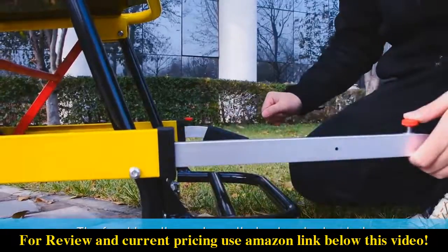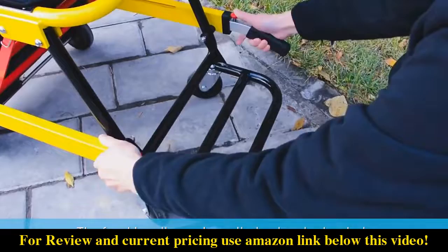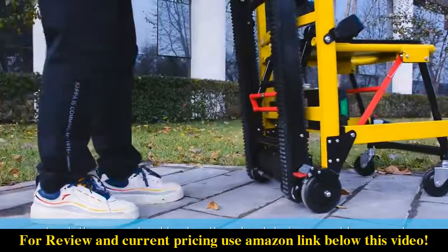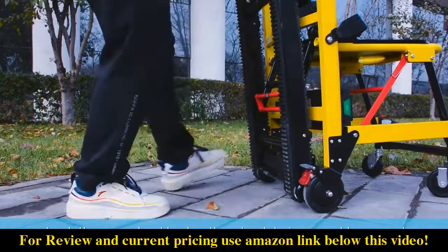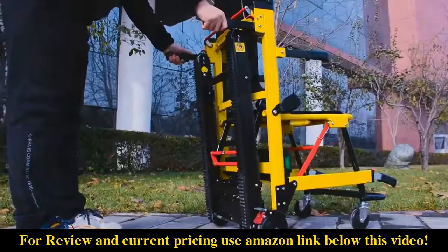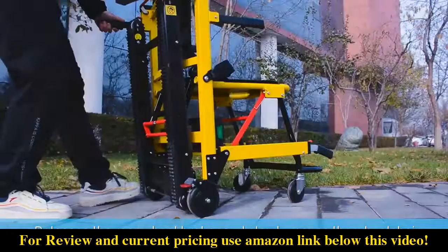The front handle can be pulled out and retracted. Lock the rear wheel brake and the wheelchair cannot be moved. Release the rear wheel brake and slowly move the wheelchair.